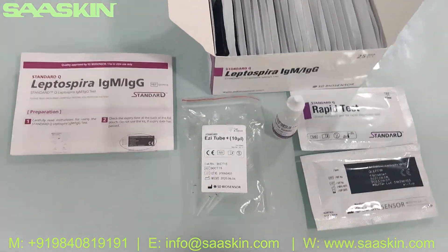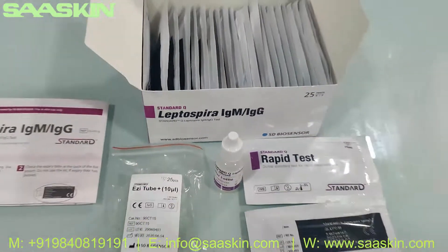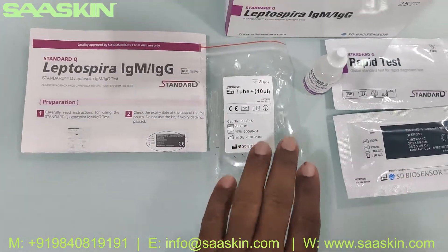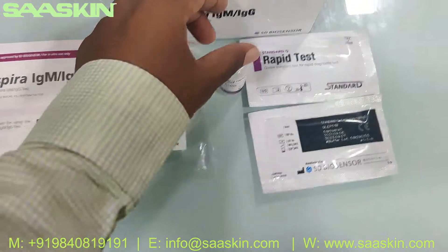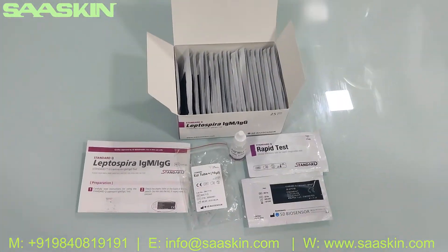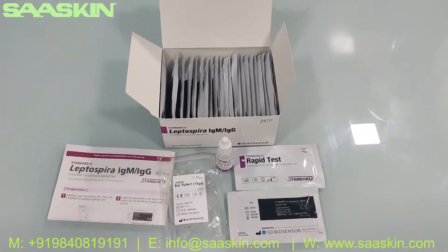If you look at it, just quickly to summarize: this is the SD Biosensor Standard Q Leptospira IgM IgG rapid antibody test kit. Inside the 25 test kit box, you get an IFU brochure — a detailed IFU brochure — and you get the sample transfer easy tube for transferring the sample, and you get the buffer bottle, and you get 25 test cassettes. This is how the total contents look like. Thank you.